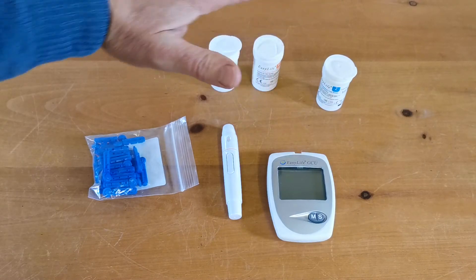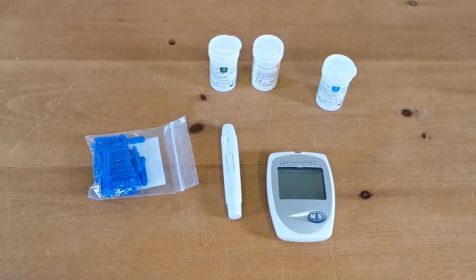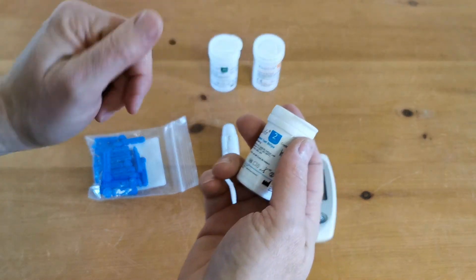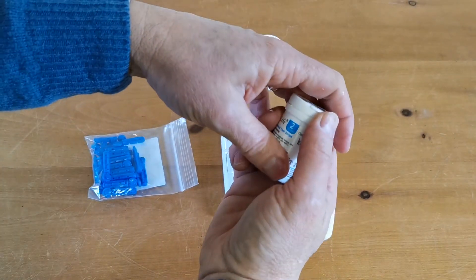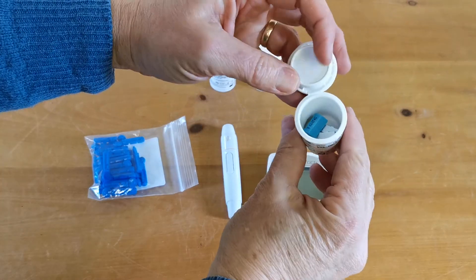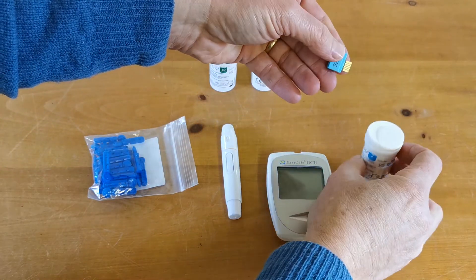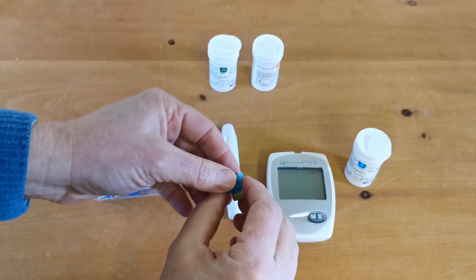When you get the meter you'll be supplied with some sample test strips. We wouldn't recommend opening these until you are ready to run your first test because you want to keep these dry, but inside will be a code chip supplied specifically for each set of strips.